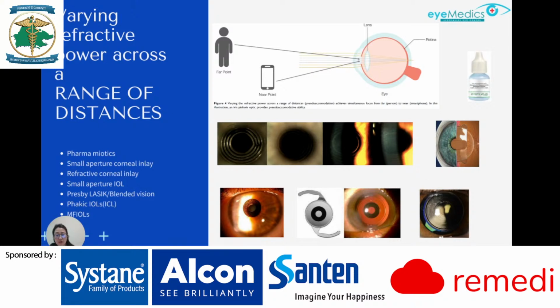Refractive optics utilizes various zones to focus incoming light rays from different distances to create a broader range of focus on the retina. Examples of this would be contact lenses, cornea refractive inlays, and also refractive intraocular lens.